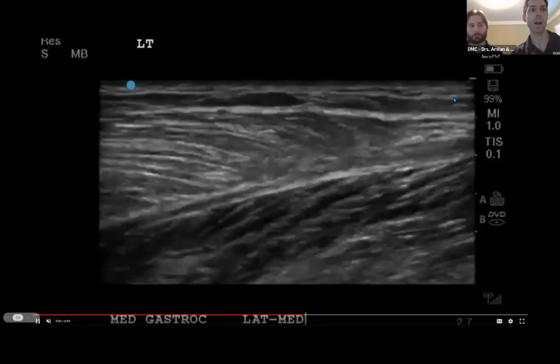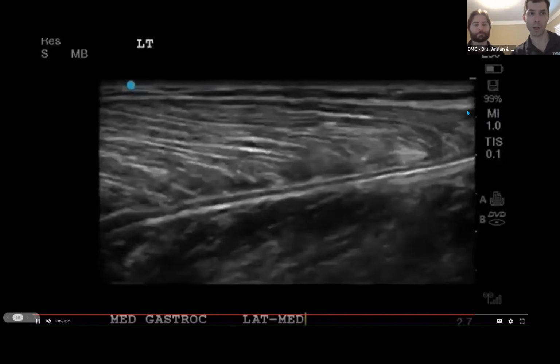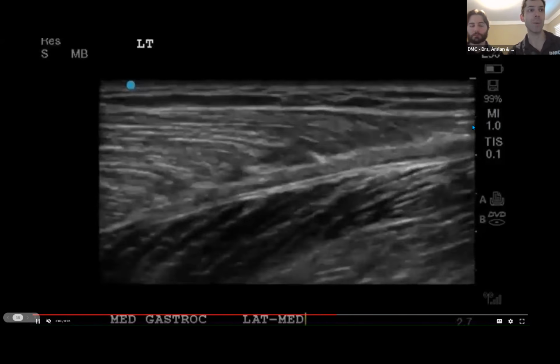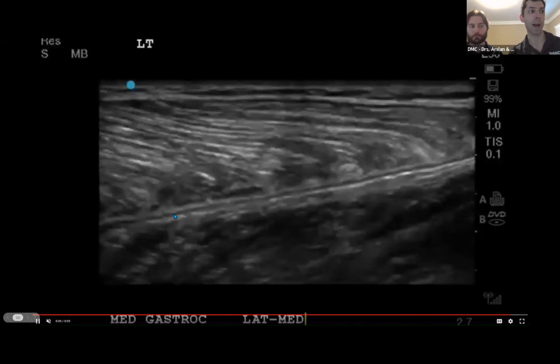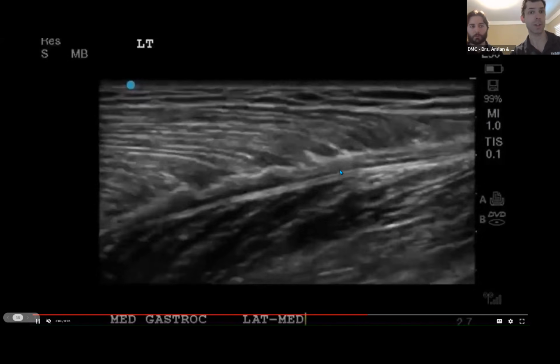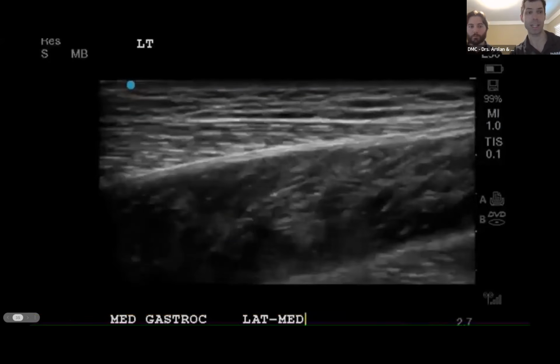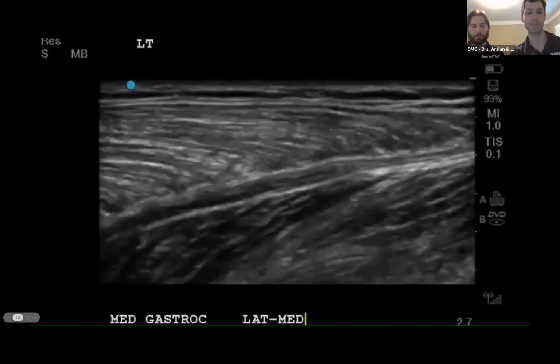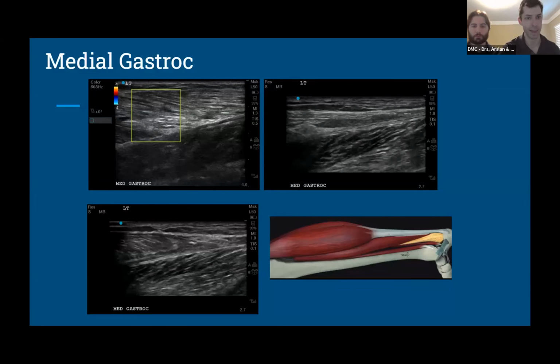And if we look at the more distal portion, the more caudal portion, we really see separation of muscle fibers. If we really fully evaluate the intraaponeurotic space, more anechoic, hypoechoic fluid consistent with bleeding. So this is our diagnosis of a grade 3 medial gastrocnemius tear, perfectly demonstrated on this video clip on this dynamic scan. Here are static images of that patient.